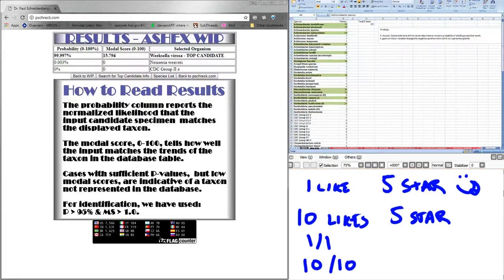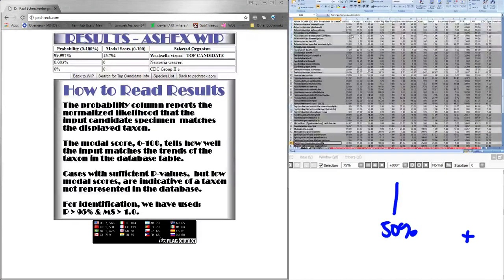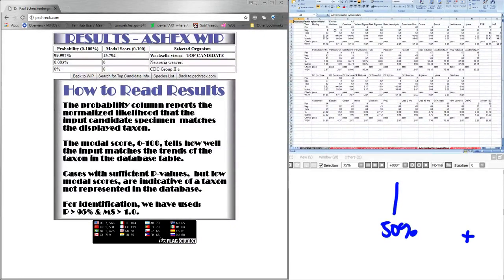Now, in the standard probability calculation, that's not true. The standard probability is calculated with everything being on an equal footing. So I've included the binomial matrix because it gives a spread. So everything kind of starts out at, say, 50%. And let's say you have a test that is always positive, right? Always positive. So I'm going to find a good example of this, and hopefully, all right, here's a perfect. Let's look at Achromobacter xylosoxidans, which has essentially been oxidase positive 100% of the time, right? There we go. 63 out of 63.